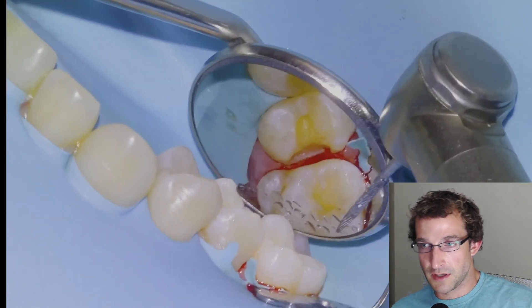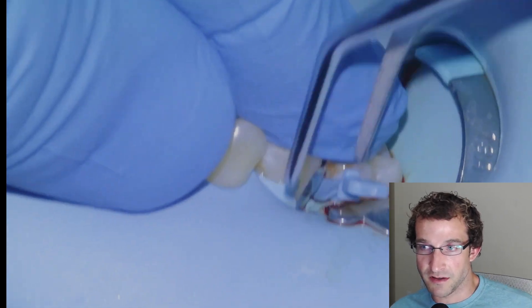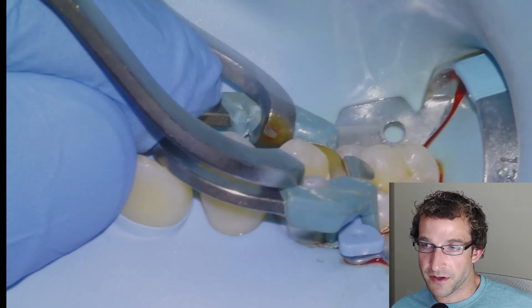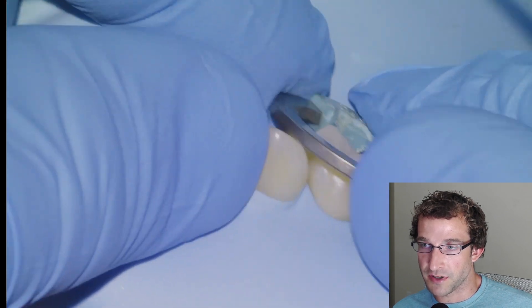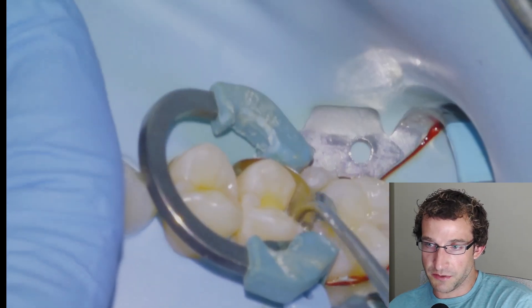We'll grab our sectional band and put it between the teeth. I like to put apical pressure on it and shimmy the wedge in and out so the band goes as deep into the sulcus as possible. Then we'll put on the separator ring, push it apically, give it a little shake to separate the PDLs as much as possible to get a good contact, and burnish with the ball burnisher against the neighboring tooth.